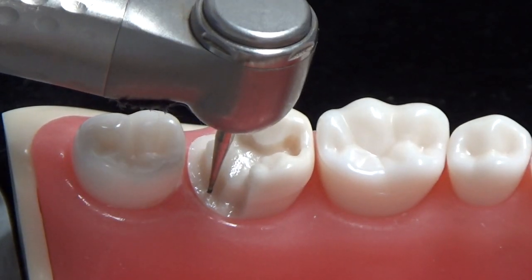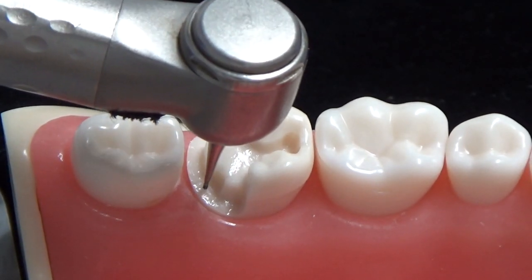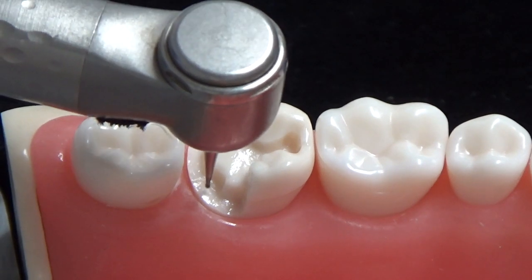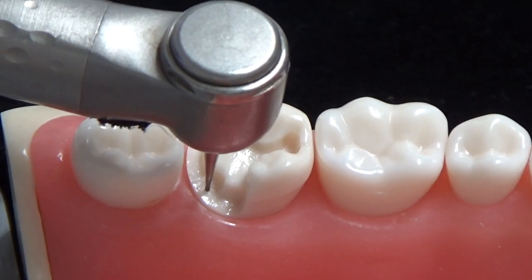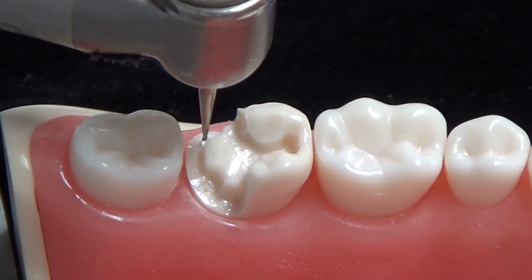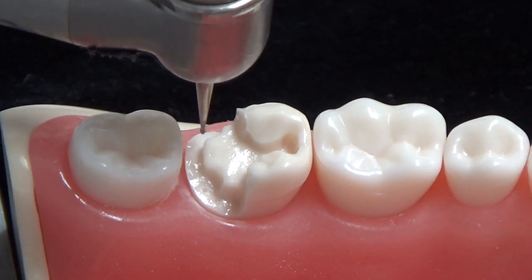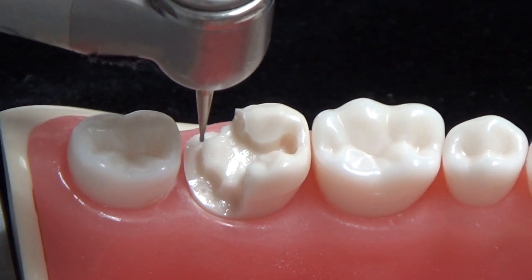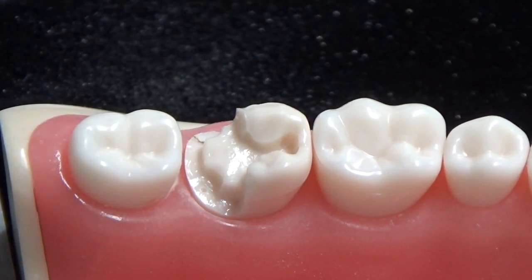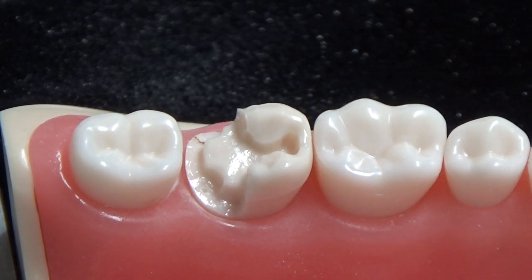We're going to go ahead and make our holes. Here we go with one, and then we'll make the other one right there — and that's it.